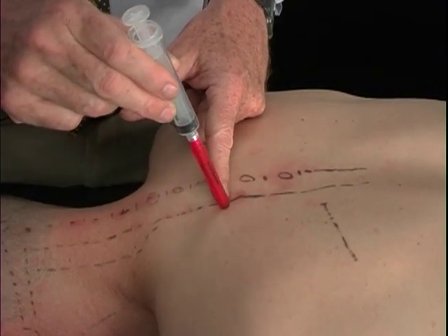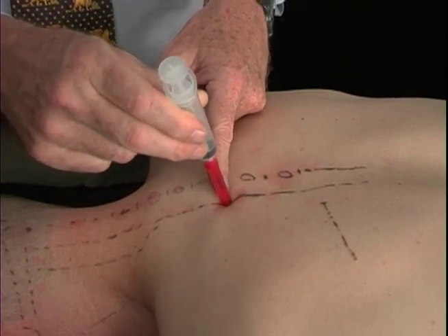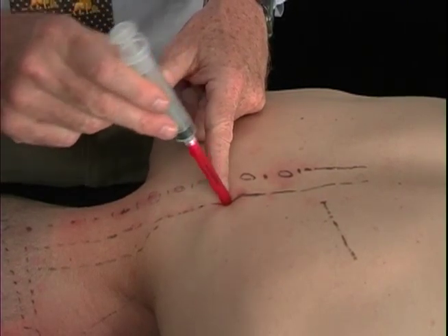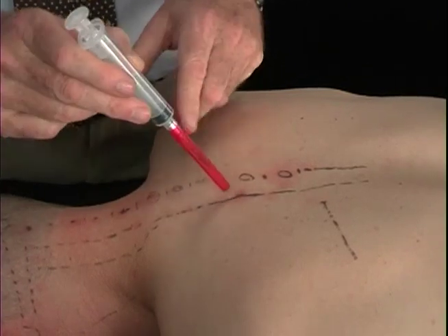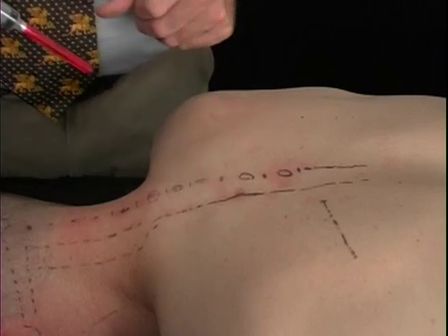So the angle of the needle needs to be not more than 15 degrees or so, so that the tip of the needle doesn't go too far down or up.